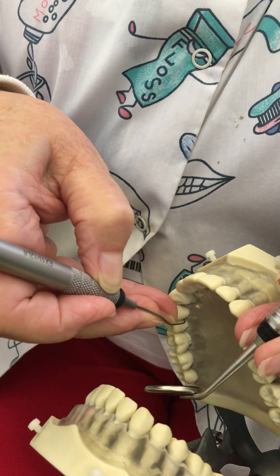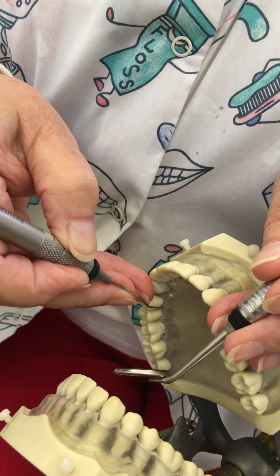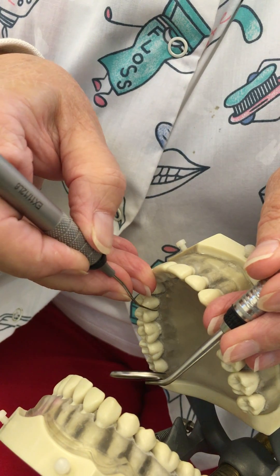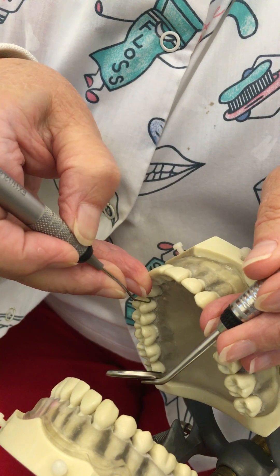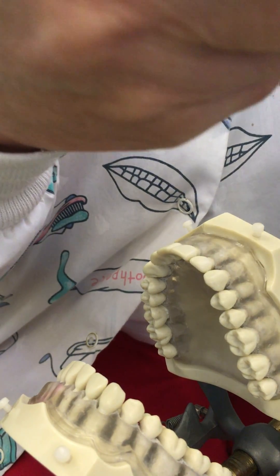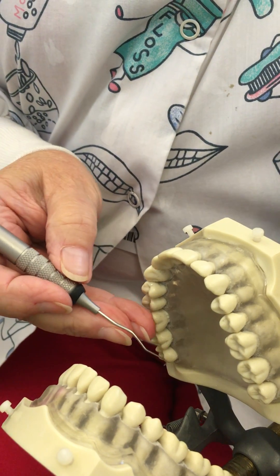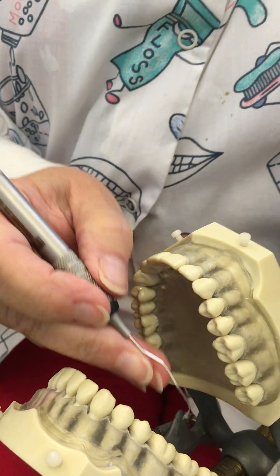Notice my handle and shank are on the same side — they're on the lingual. I just back my fulcrum up as I move from tooth to tooth. All three of my fingers are forced to stay together — that's what you want. Now we're going to move to area four.